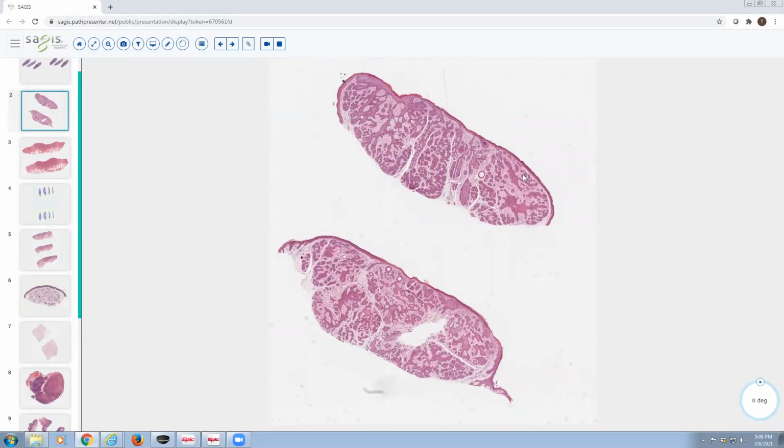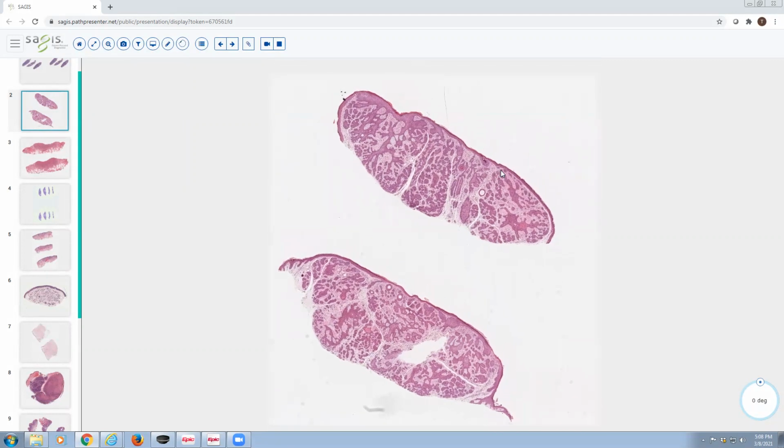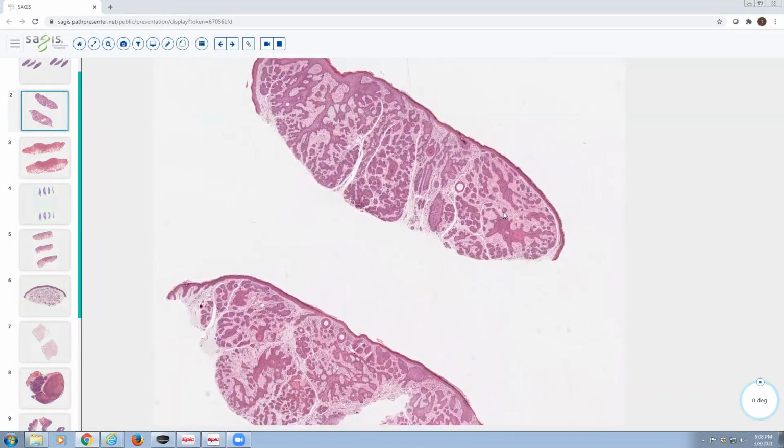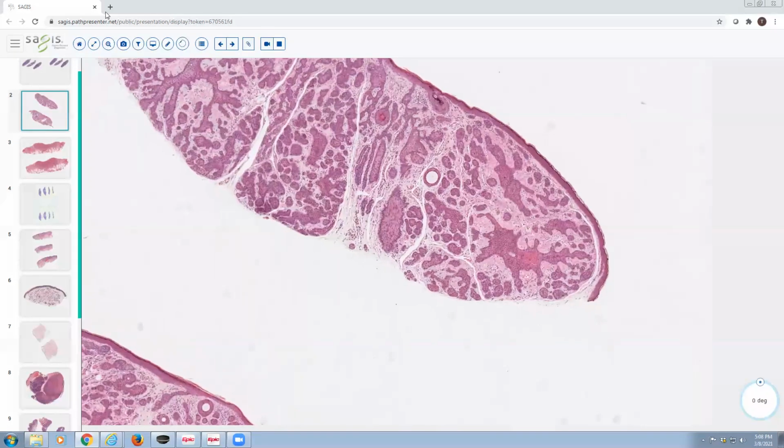And consequently, a more terminally differentiated neoplasm will show a little bit more pink color on scanning. So that's why this version of basal cell carcinoma looks a little bit more pink rather than purple on scanning, and that's because it's more terminally differentiated. So less primitive, more differentiated, and it's differentiated towards the hair follicle. And the reason that we know that is because there's little follicular cysts.